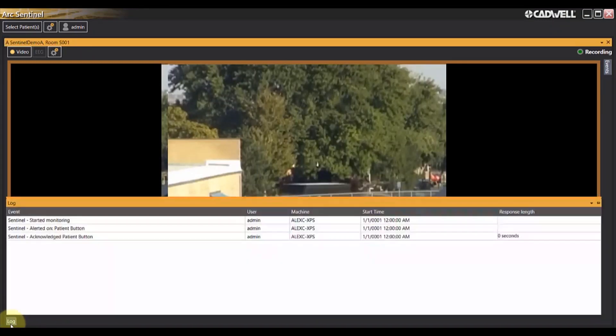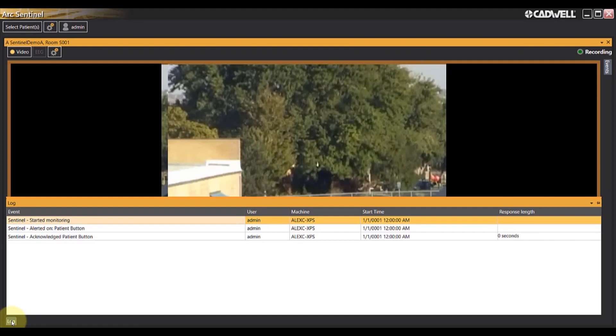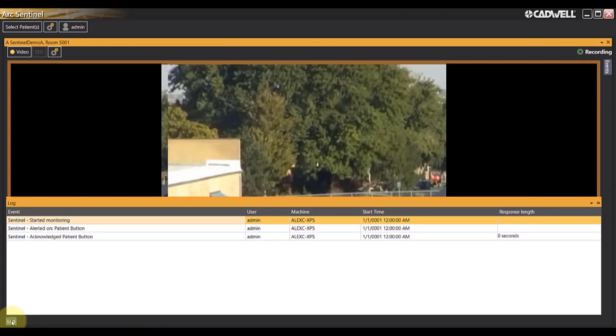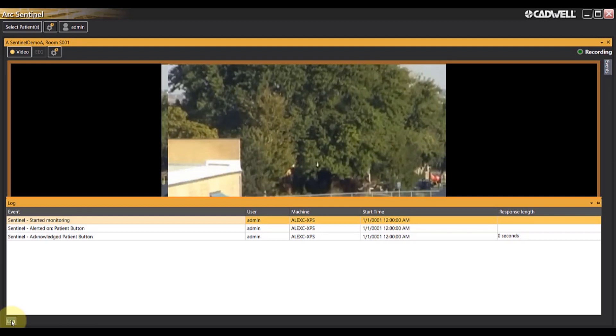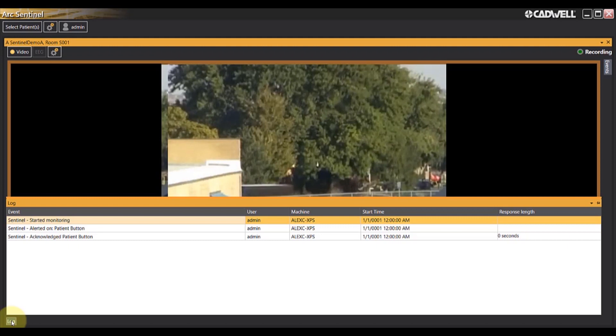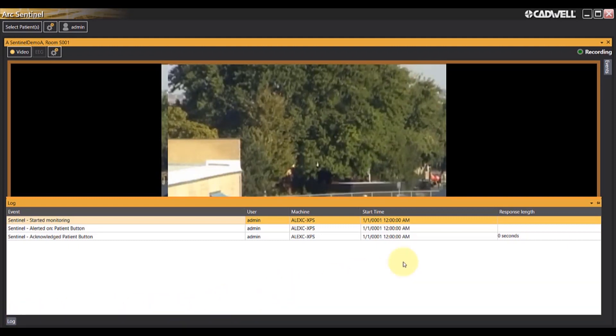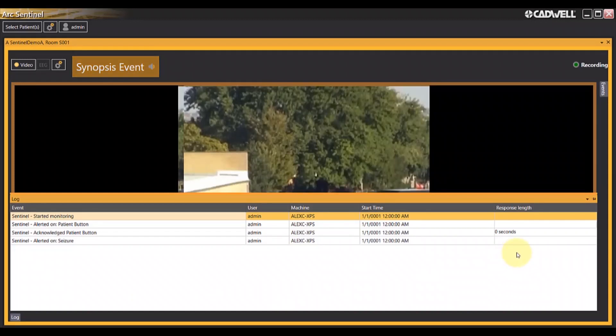At the bottom of your Sentinel screen, there is a log button. When the log button is pressed, it will show you which notifications have been delivered by the Sentinel software and how long the response time was to acknowledge each one of those notifications.